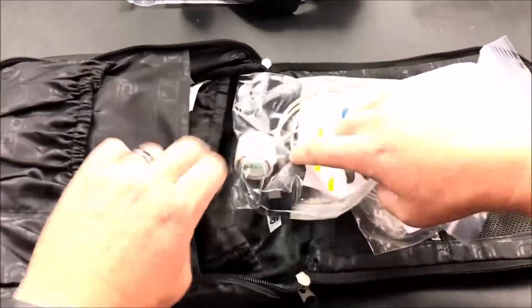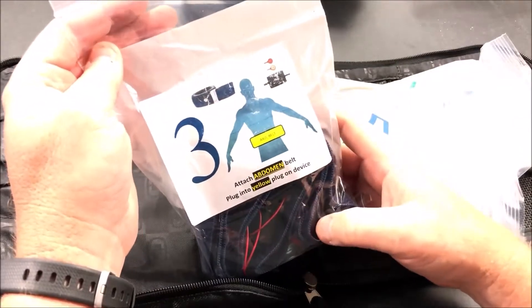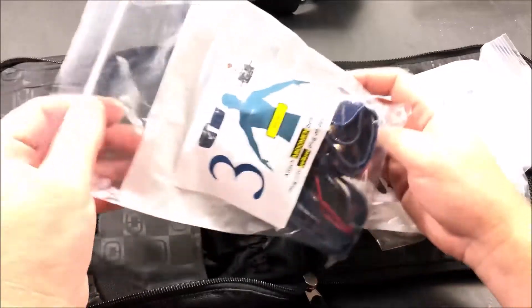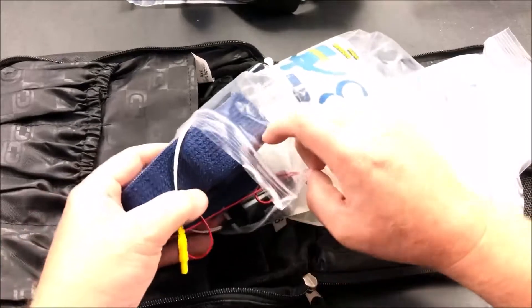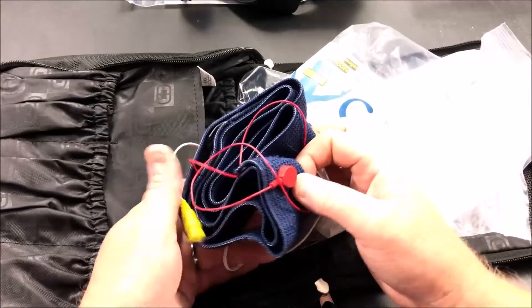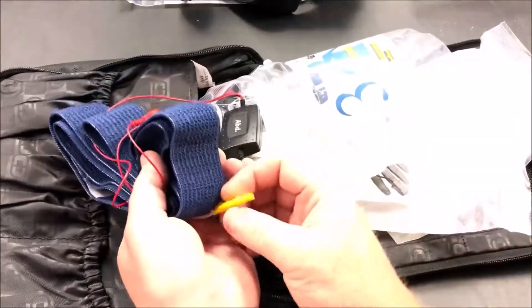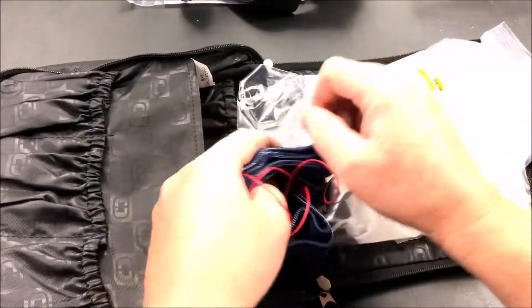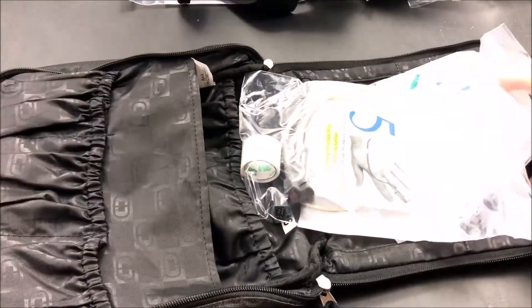Bag number three has the abdomen belt, and this goes just around the belly button area, they told me. It's very similar to the chest one — it has a velcro-type strap that goes around your body, and then it has a couple of snaps. This one has a yellow color-coded connector that will go onto the central control device that's recording all the data.